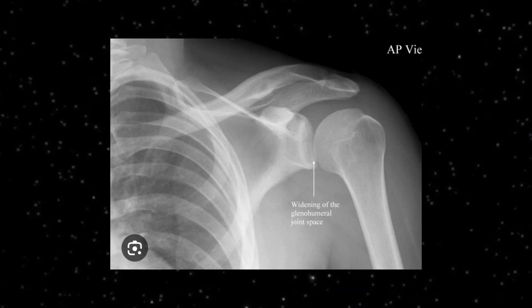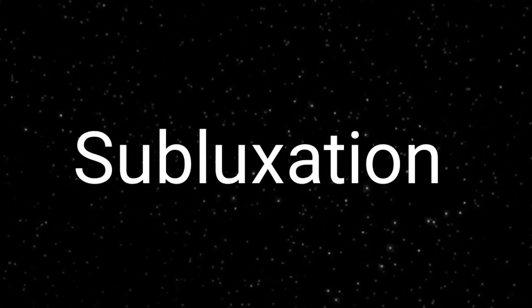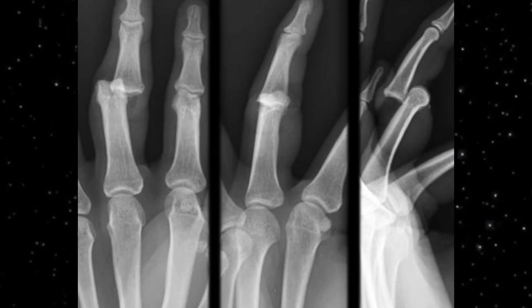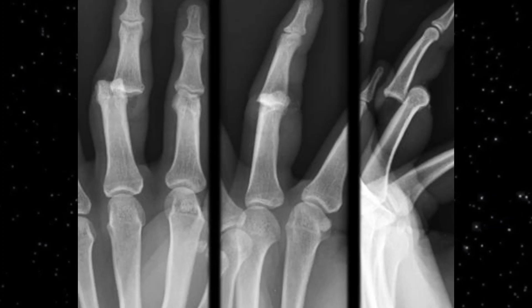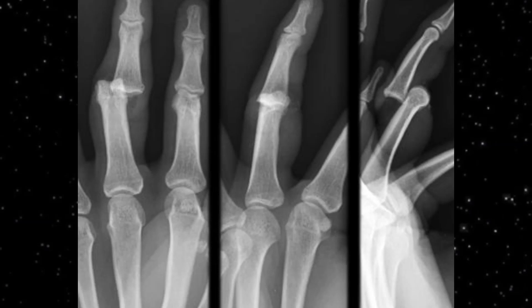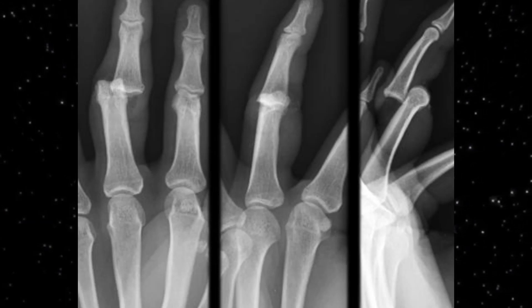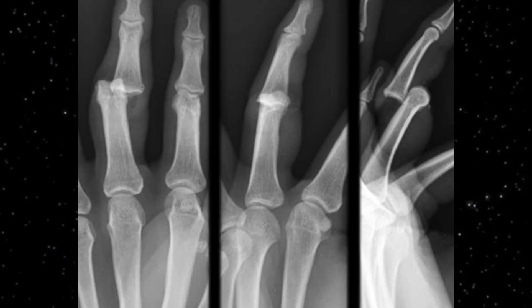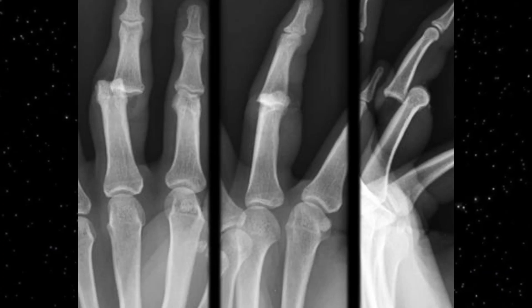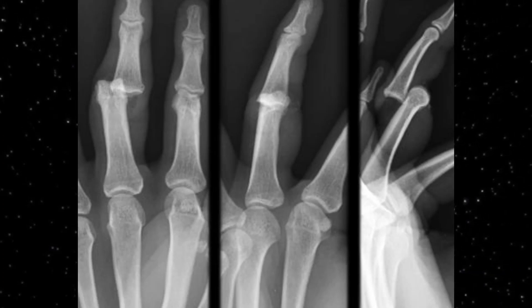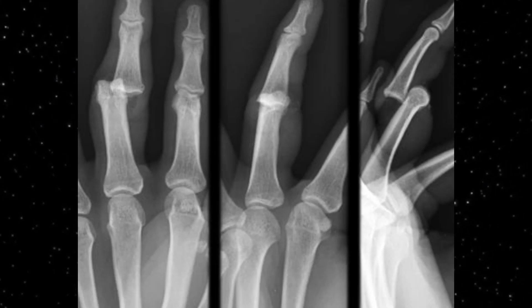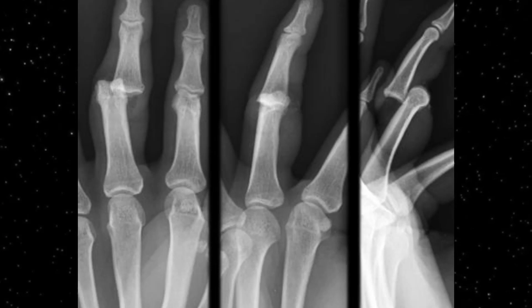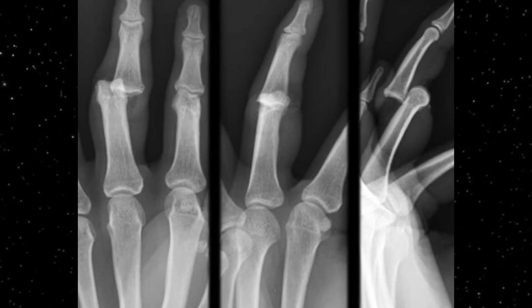After confirming dislocation, you should also look for subluxation. In subluxation there will be some partial contact between the articular surfaces. This is an example of subluxation — a radiograph of a mature hand where some bones have been subluxed, especially at the distal joint. Subluxation means there is still partial contact between the articular surfaces, not centrally but just to the side — you would have to write the word subluxation.